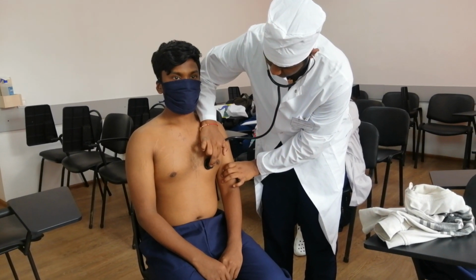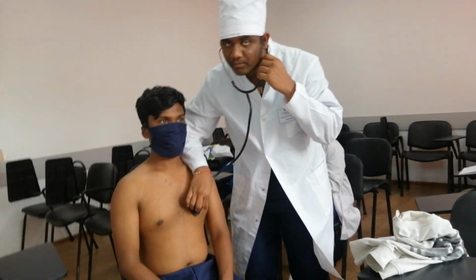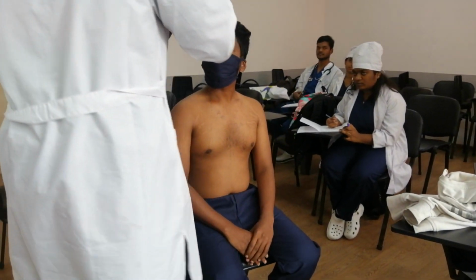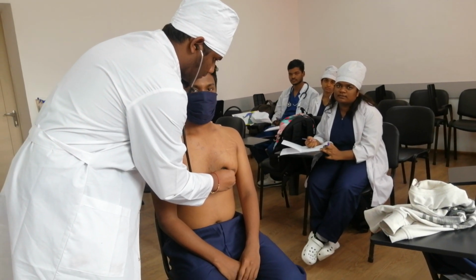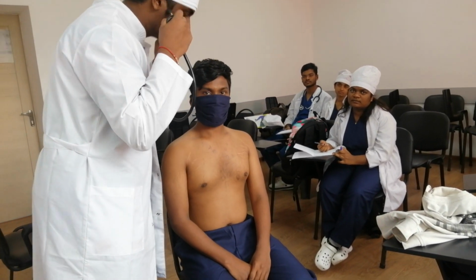Stand on the right side of the patient. Okay. Listening. Are you listening to the sound? Yes. Okay, next point.